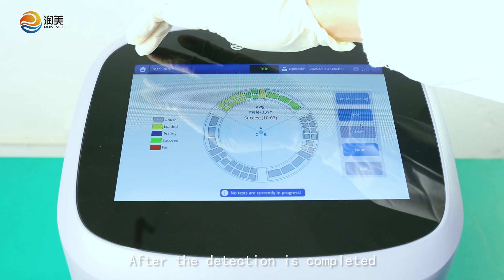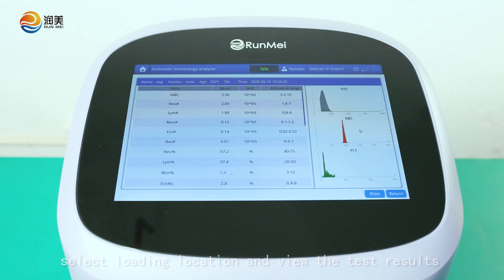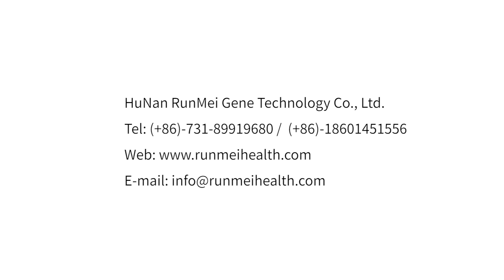After the detection is completed, select the loading location and view the test results. Select the next step and click Next.